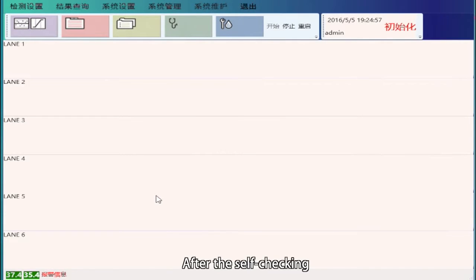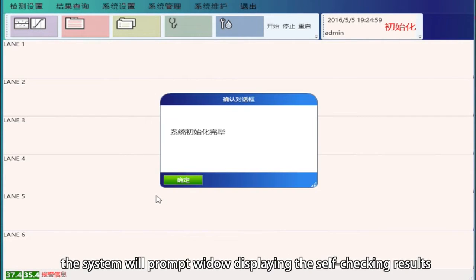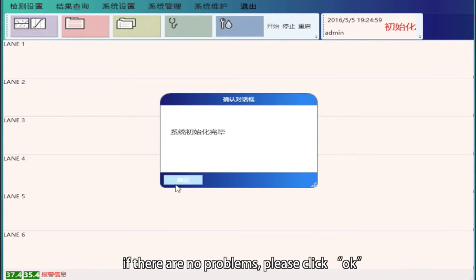After the self-checking, the system will prompt a window displaying the self-checking results. If there are no problems, please click OK.